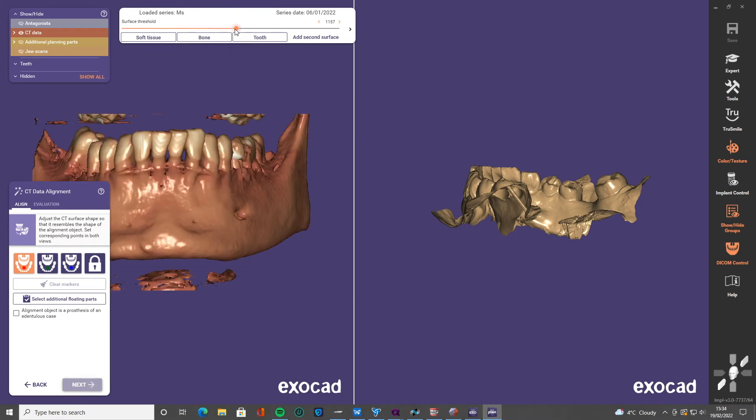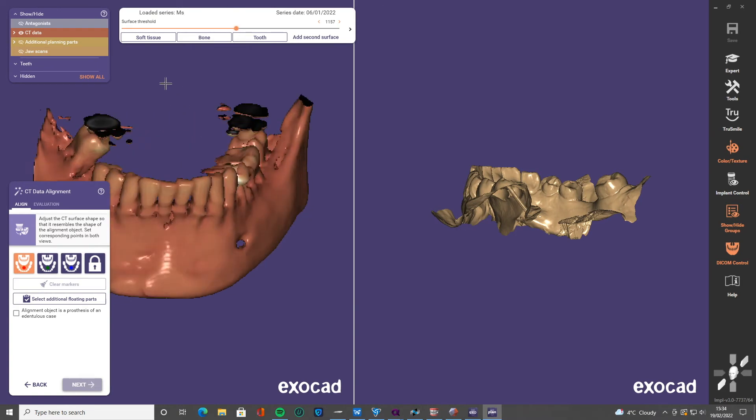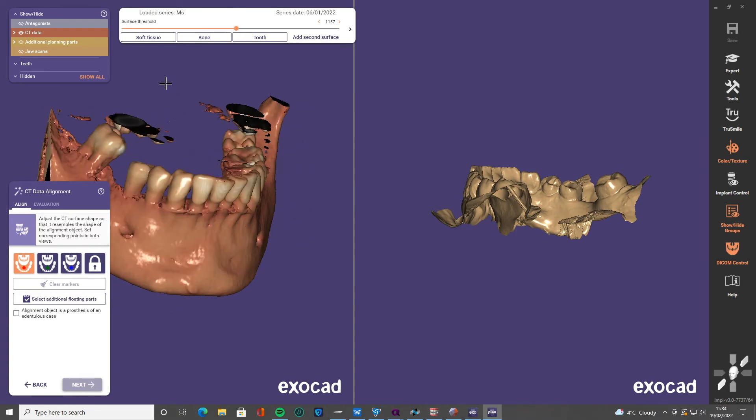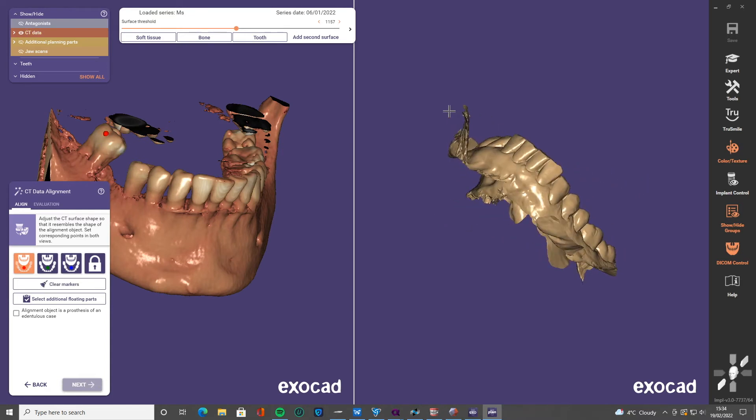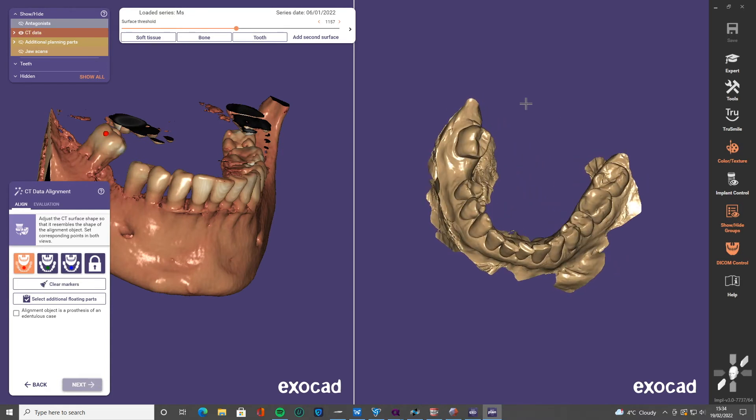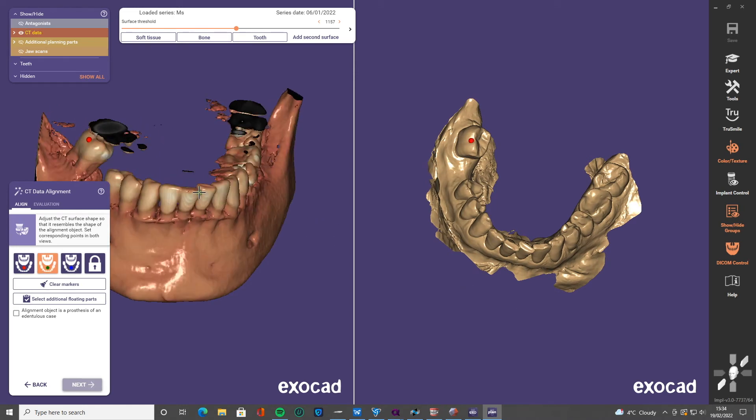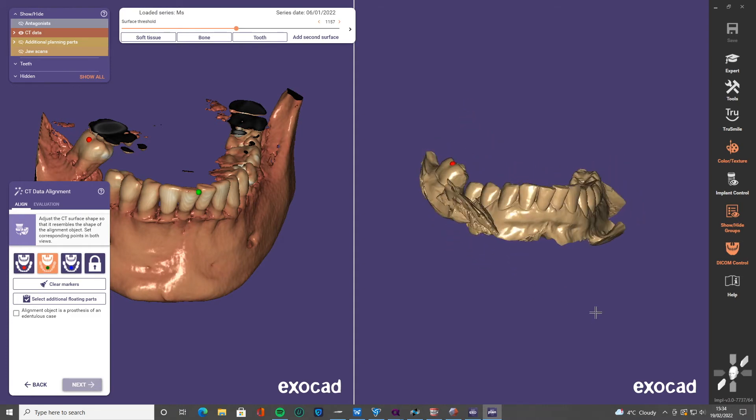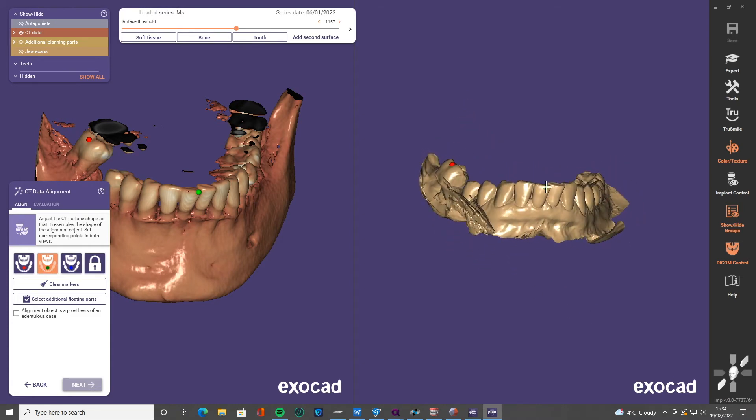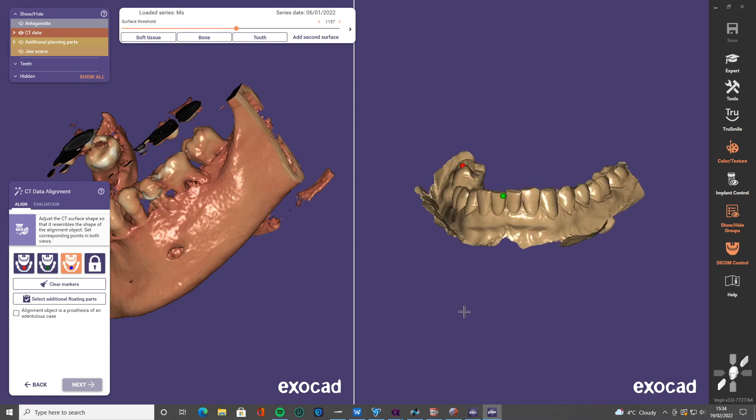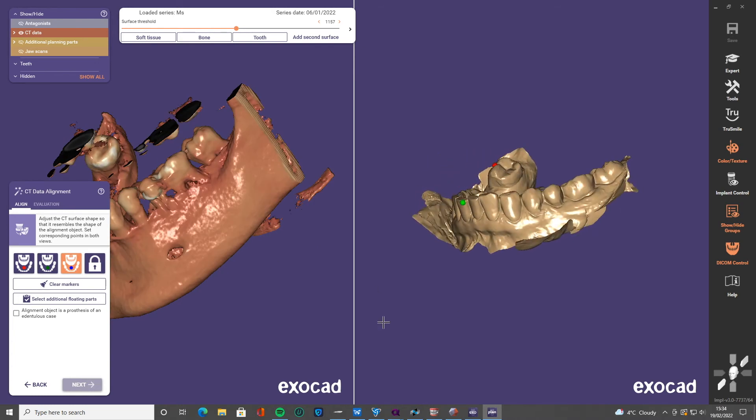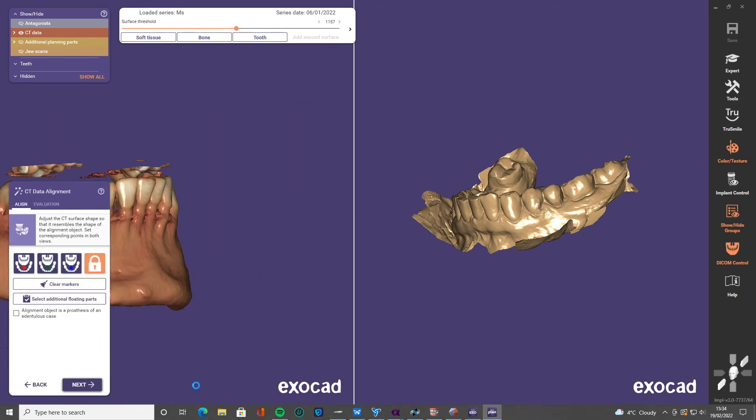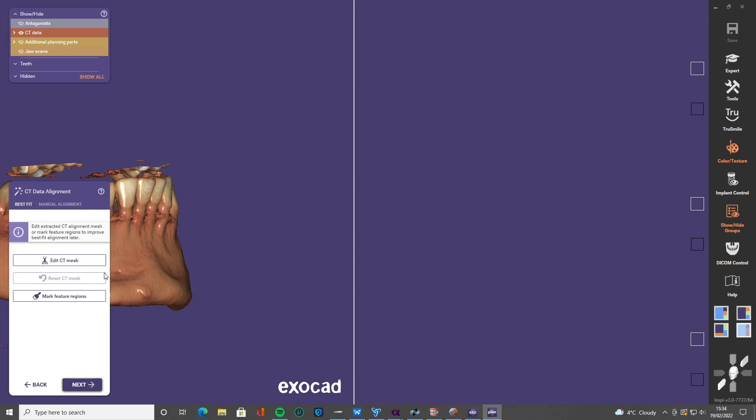So same as always, we're going to click three points and we're going to triangulate the position. Let's move this around, click three common points. Something I always say when we're teaching this is that really you want to pick three points that are as far apart as you can see that are reliably traceable in both the scan and also in the DICOM data. So if you can't see something very easily, then don't pick it. But if you can, if it's a good angle, an edge of a tooth, something like that, then great.